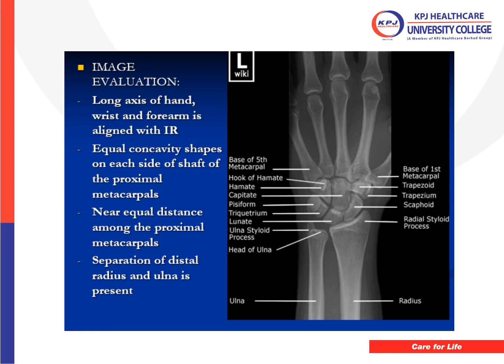We can know the centering point is correct, it is in the center when you do the cross, like an imaginary line cross. If the crosshair is correct, yes, this is exactly at the middle. Okay, this is just to ensure. Alright, so this mentions that the long axis of the hand, wrist and forearm is aligned. So collimation, tight collimation applied, include the soft tissue like in the lateral side.